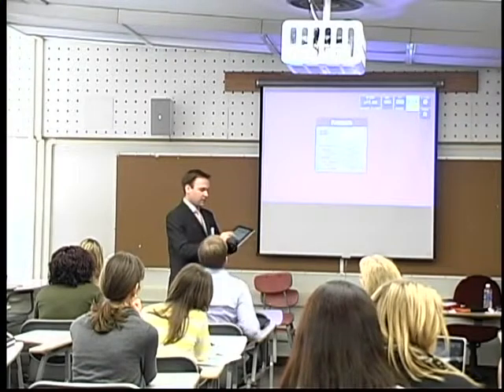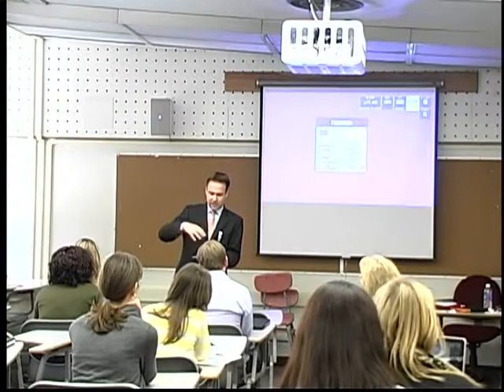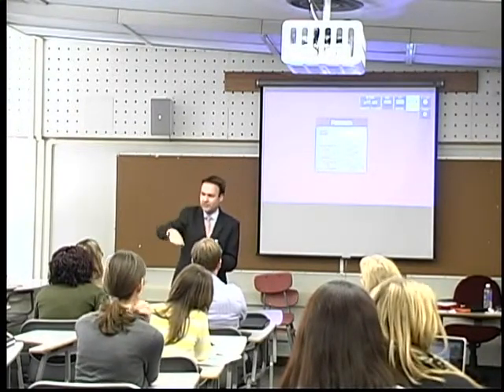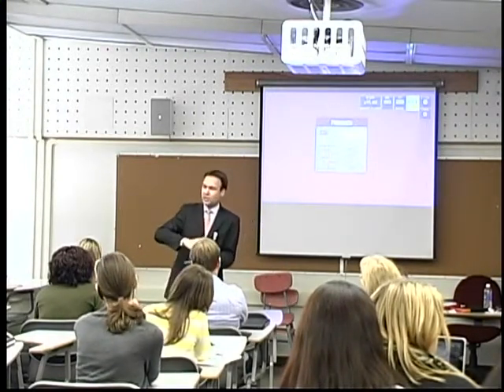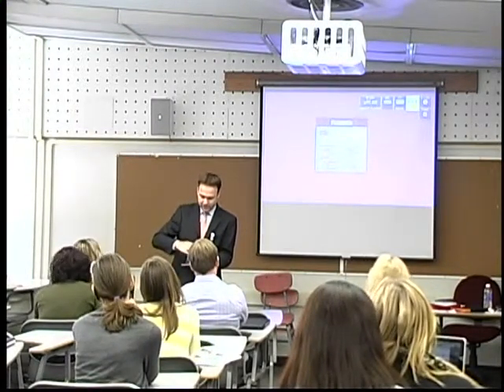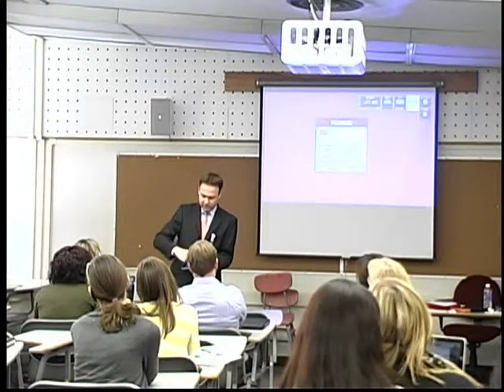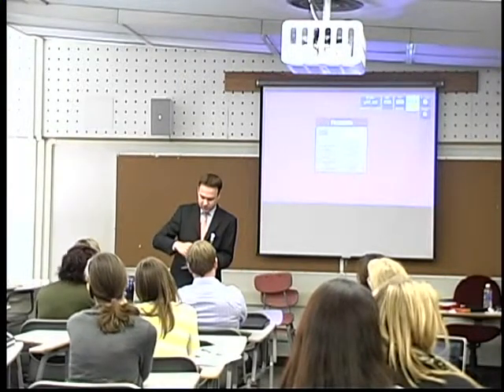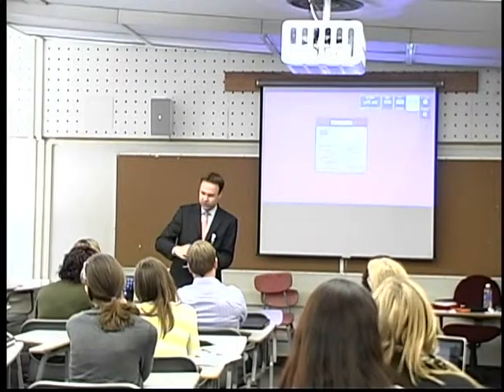And this is a way to avoid too much of a categorical organization, because I never have to go from a subordinate category to one below and one below, because the screen never changes. I'm selecting my different contexts up here, and then within the context, I get a new selection area, and I can start dragging symbols down. I can also combine those symbols with the ones from another activity sheet, and within each one, I can go back and forth.